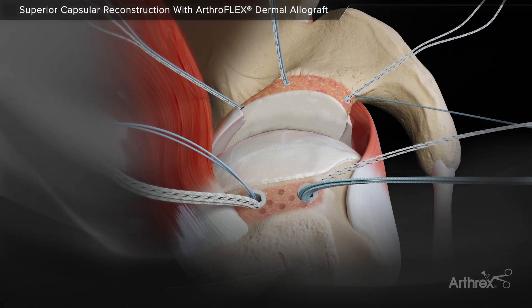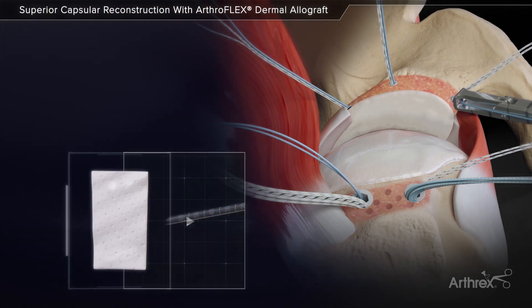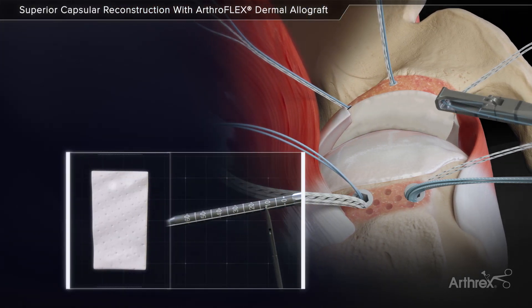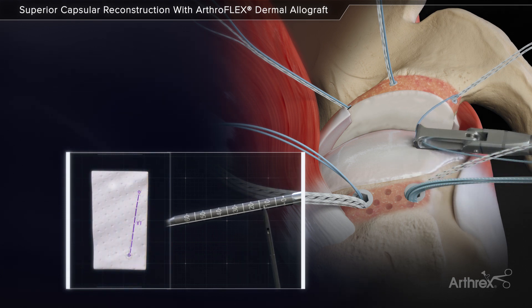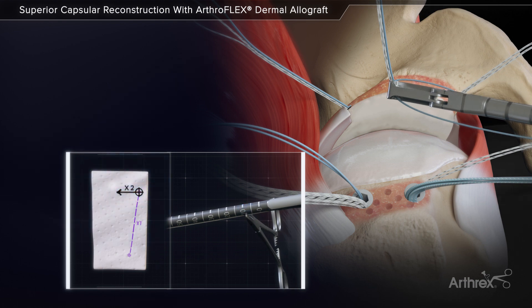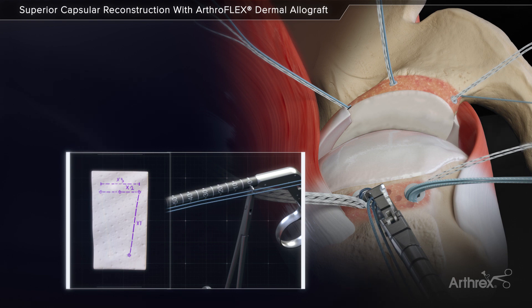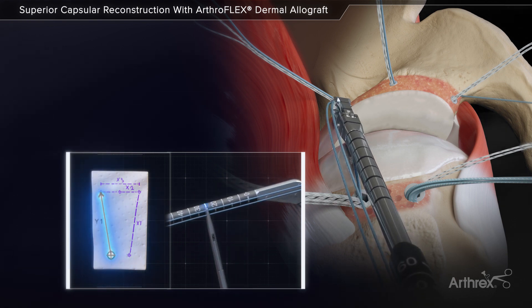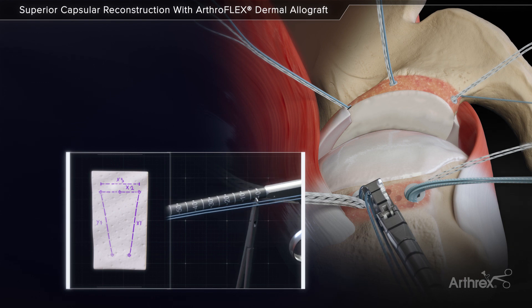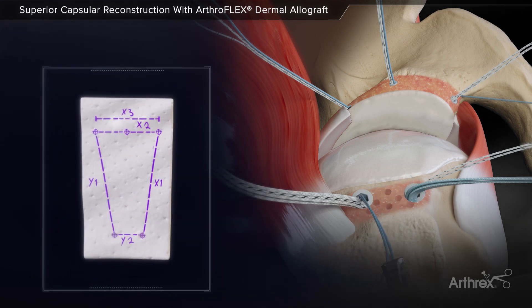The SCR guide is used to estimate the distances between the anchor positions, utilizing the suture from the anchors. As the SCR guide shifts from anchor to anchor, the relative suture position identifies the distances between anchors.